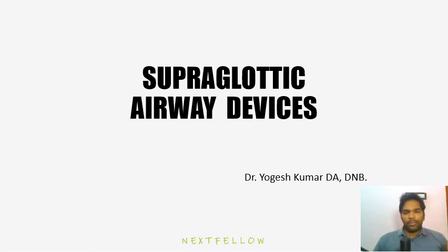In the first topic we will see the introduction, the importance and uses of supraglottic airway devices, and in the second topic we will see the individual airway LMA devices. Supraglottic airway devices are also called laryngeal mask airway, or LMA.